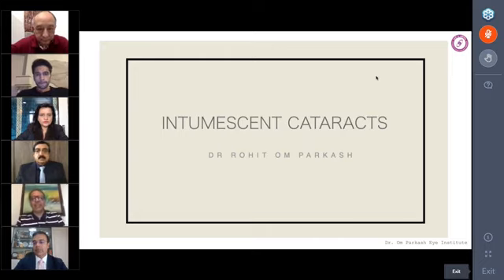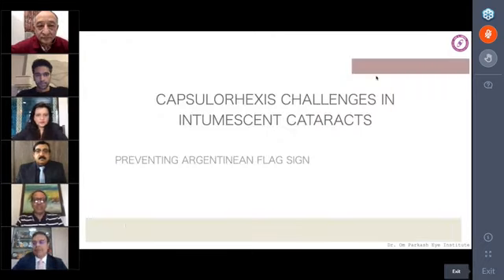First of all, I would like to thank Dr. Ashwin for coming out with such a stupendous symposium. All of us know that Ashwin is a gem in ophthalmology. He has given me the topic of intumescent cataracts. Well, these intumescent cataracts pose the biggest challenge while performing capsulorhexis, because more often than not, each one of us has ended up with an Argentinian flag sign.